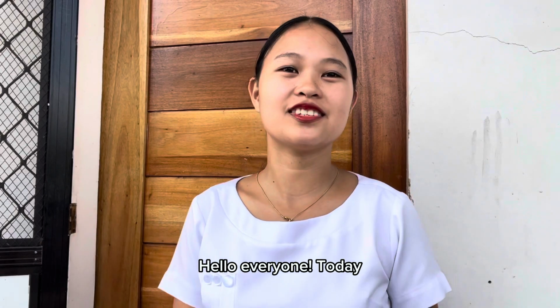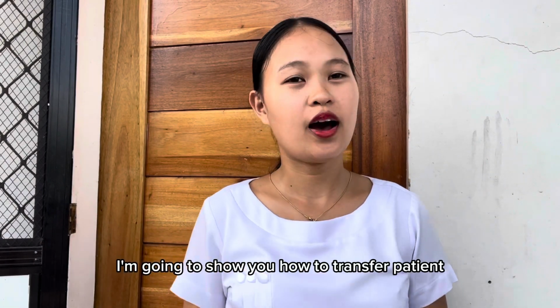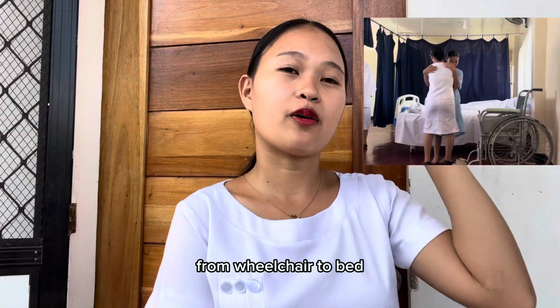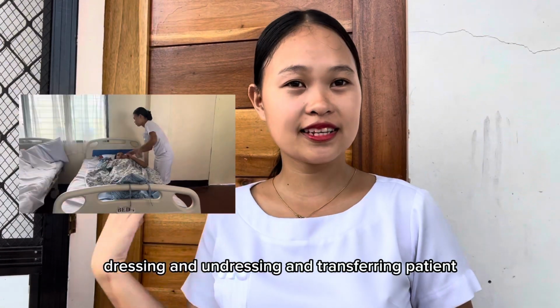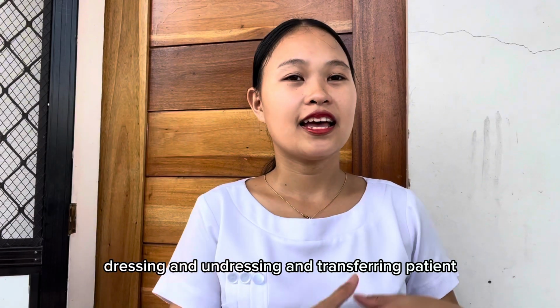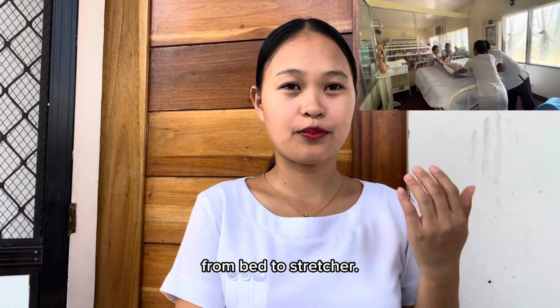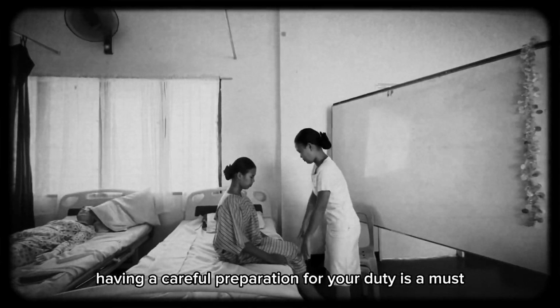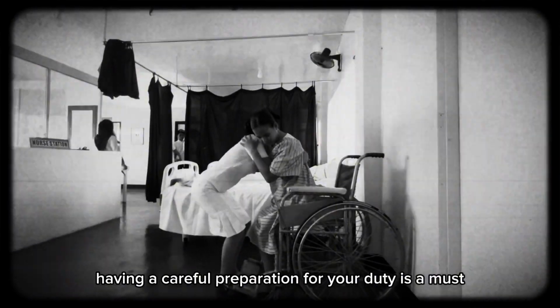Hello everyone, today I'm going to show you how to transfer a patient from bed to wheelchair, from wheelchair to bed, dressing and undressing, and transferring a patient from bed to stretcher. Let's go! Having a careful preparation for your duty is a must.